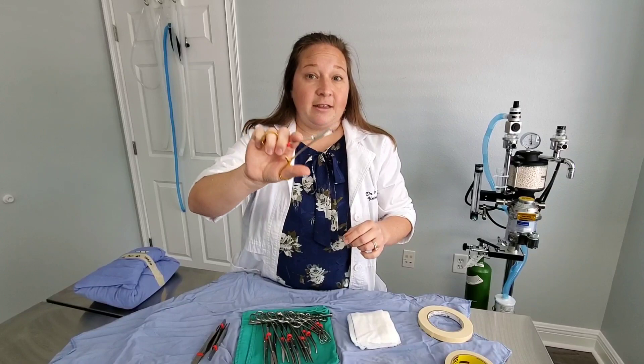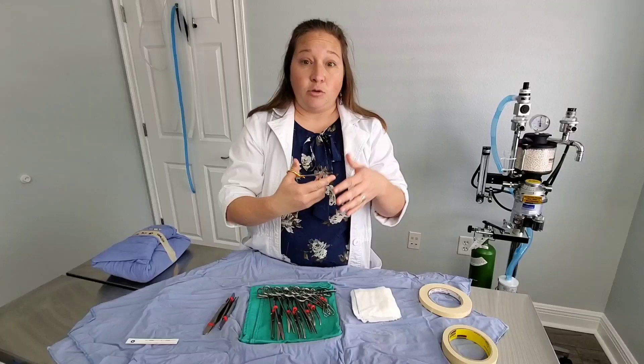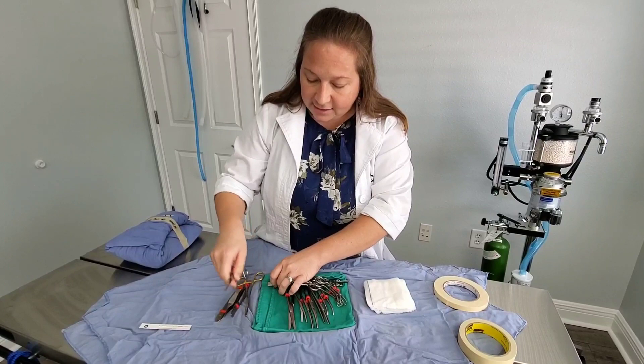Since I can grab the needle and cut it with the same device, these are very efficient. They come in different sizes — a lot of equine surgeons use really long ones for getting into deep places. I have little hands and work on small animals, so I really like these smaller ones, but they do make these in many different sizes.